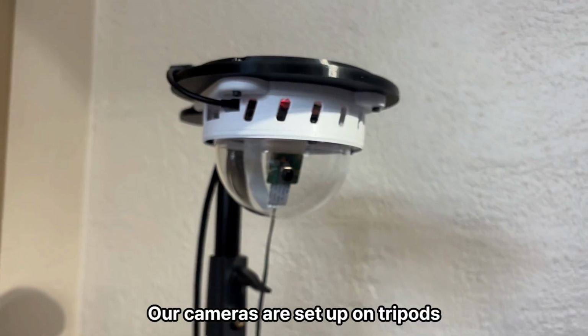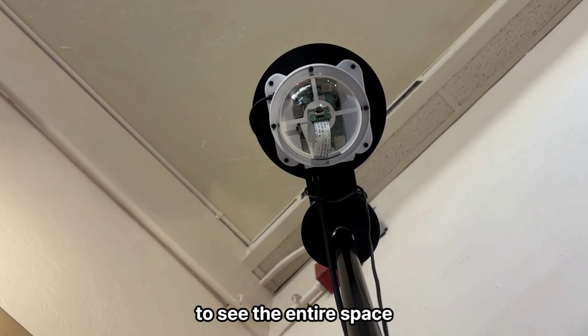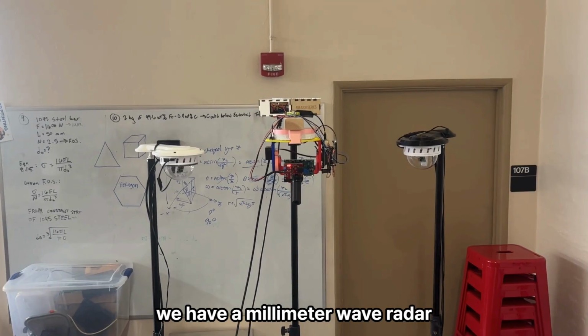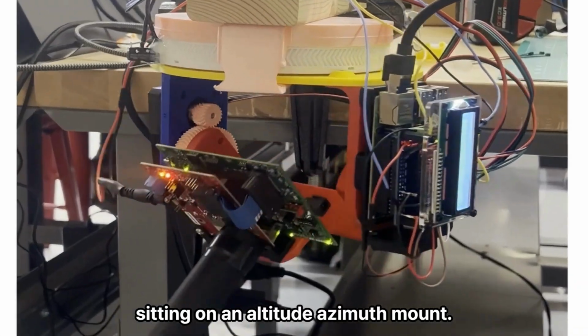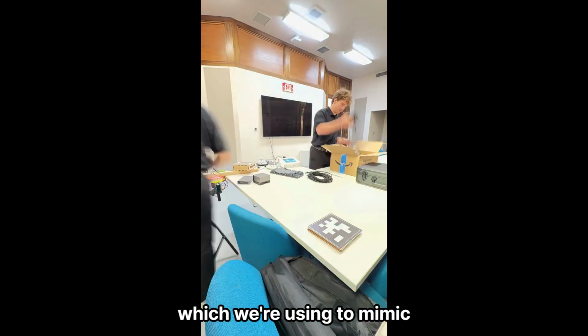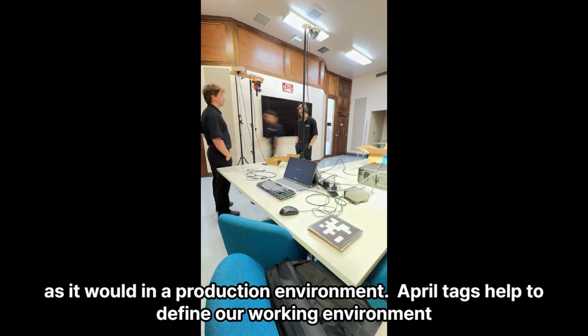Our cameras are set up on tripods in corners of the room. This gives us the ability to see the entire space and ensure we have full room coverage. Between the two cameras, we have a millimeter wave radar sitting on an altitude azimuth mount. Currently, our system sits on tripods, which we're using to mimic being mounted on the ceiling as it would be in a production environment.